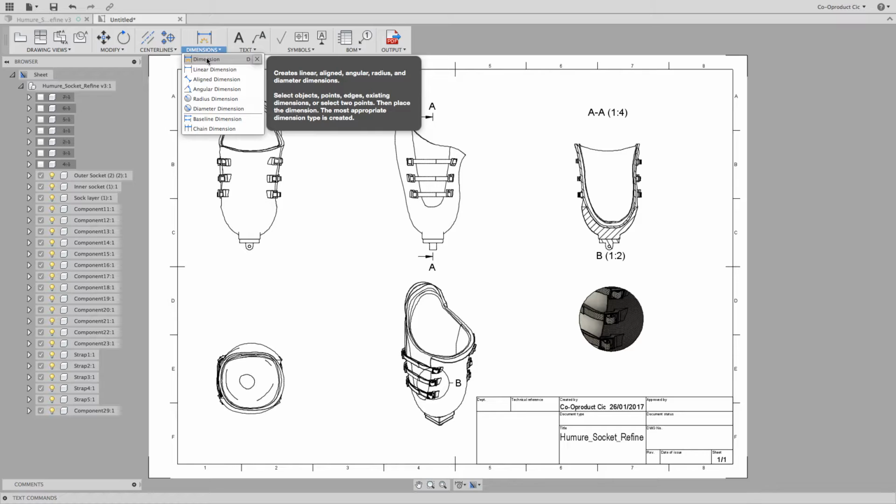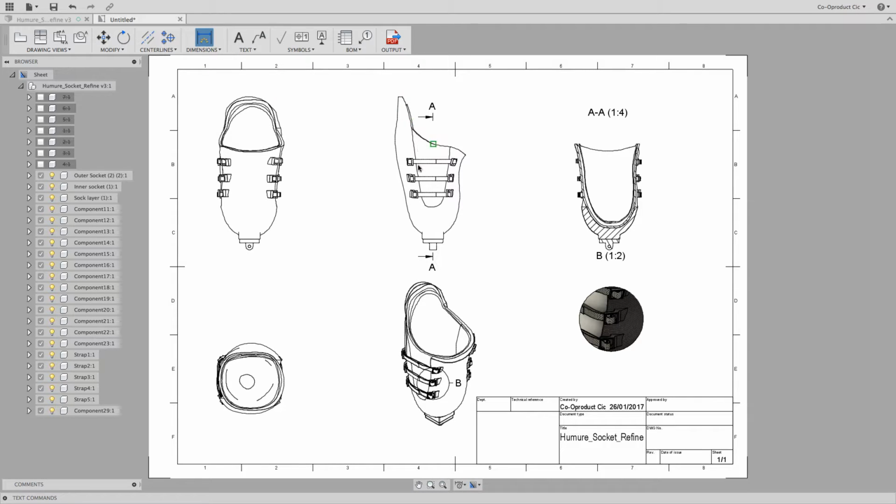So for example, if I click Dimension, and then on this view, perhaps take the top of the socket here to the bottom of the socket knee joint here, drag to the left, and Fusion displays the dimension for that distance. And we can do that multiple times on any part, on any drawing for any distance. We can also add text and text leaders, which is what I'm going to do now. In the toolbar, select Text, then Leader.